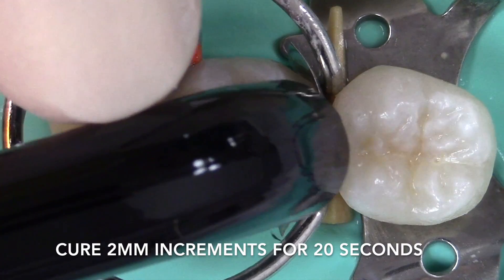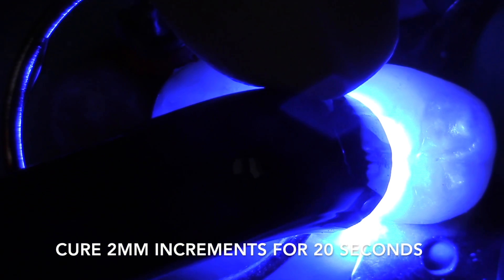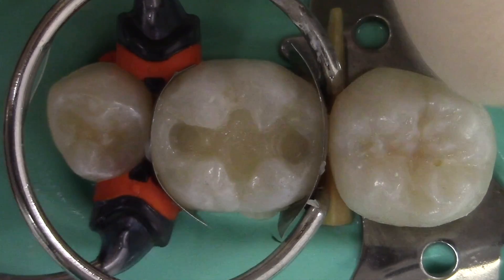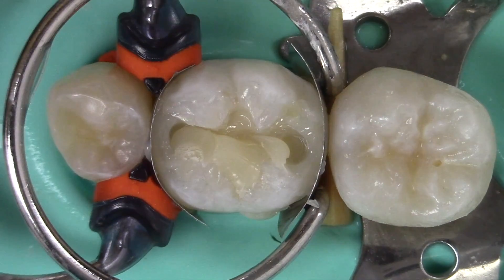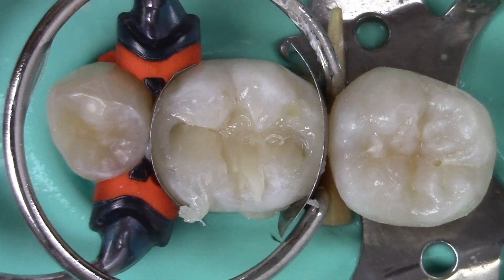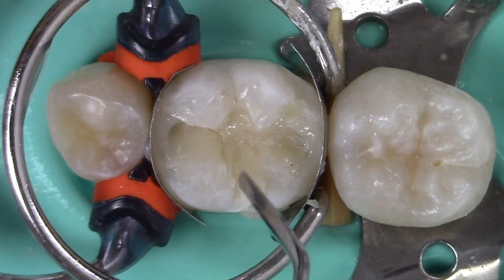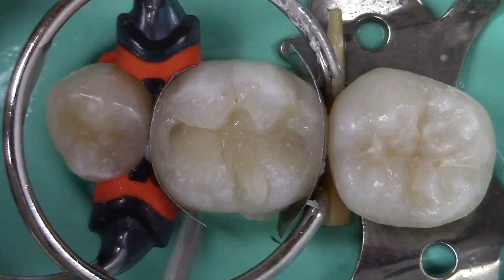The composite is light cured in two-millimeter increments for 20 seconds. The composite is then forcefully extruded against the lingual wall of the preparation and condensed against the side of the preparation to form an oblique layer. The anatomy of the remaining tooth is followed to form the shape of the restoration.